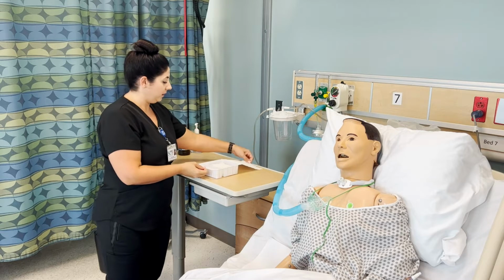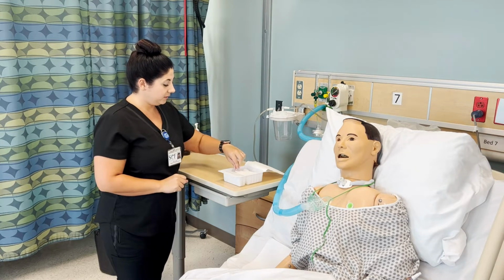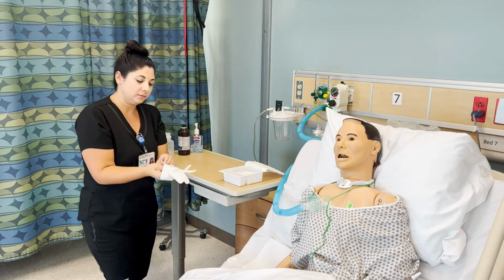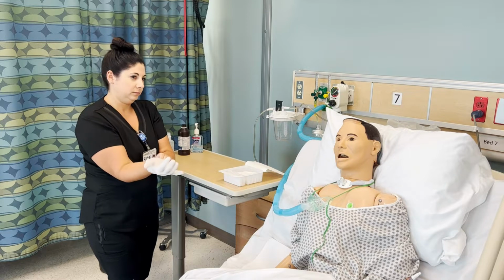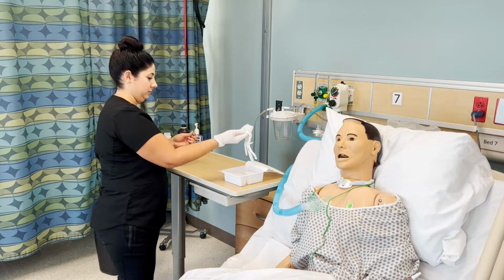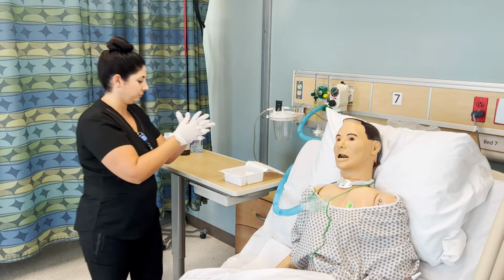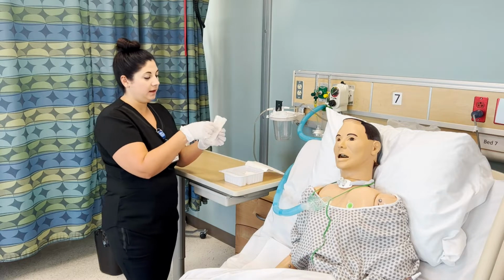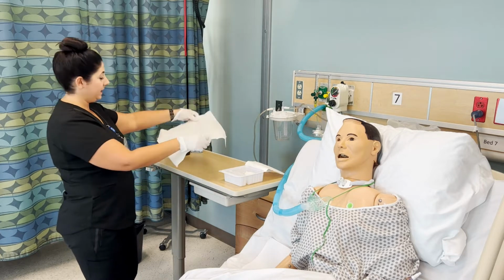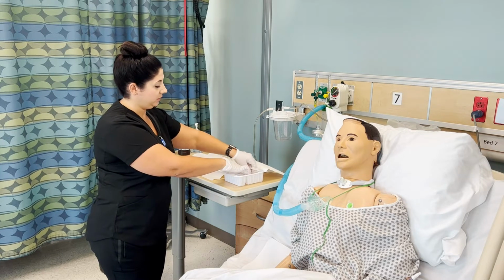I'll go ahead and open our kit, making sure to only touch the edges. We have sterile gloves in here. So I'll put those on first. And set up our sterile field. Make sure you're placing this with the shiny side down on the table. And then you can pull out your equipment.